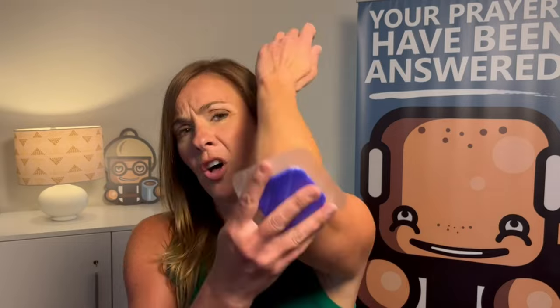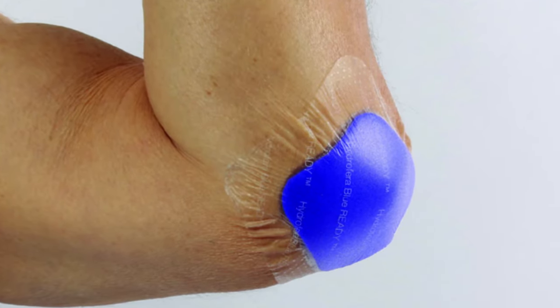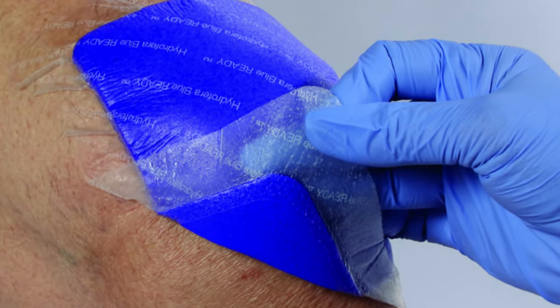This is actually ideal for a difficult-to-bandage place, because the other dressings need a secondary dressing to hold them in place. This is ideal for somewhere like a knee or an elbow — you just don't need that secondary dressing and it will stay in place. If you need to reposition, it will come off painlessly and won't disturb any of that new skin growing underneath.